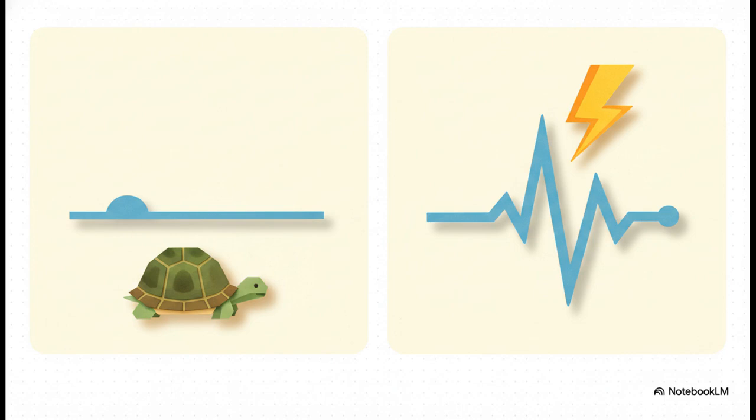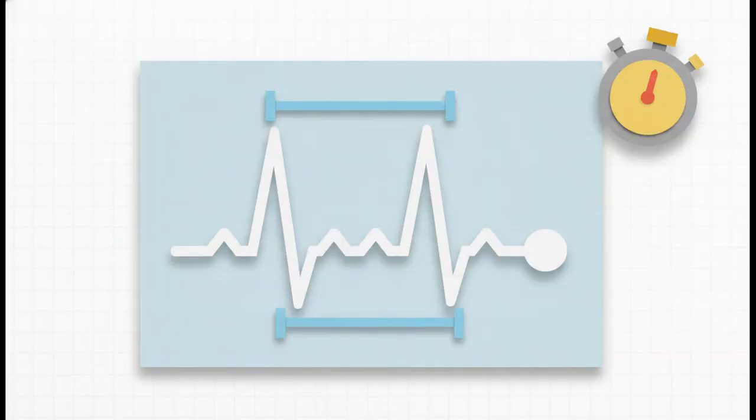Compare that relatively long AV junction travel time to the normal QRS duration of 100 to 110 milliseconds or less. The heart deliberately pauses, it waits, to let the ventricles completely fill with blood before triggering that lightning-fast ventricular firing. There are a couple of other key measurements you absolutely need to know.